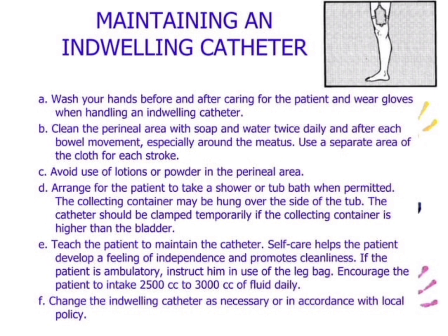Wash your hands before and after caring for the patient and wear gloves when handling an indwelling catheter. Clean the perineal area with soap and water twice daily and after each bowel movement, especially around the meatus. Use a separate area of the cloth for each stroke. Avoid use of lotions or powder in the perineal area.